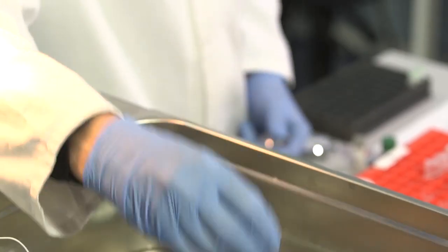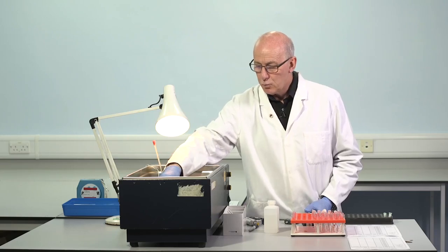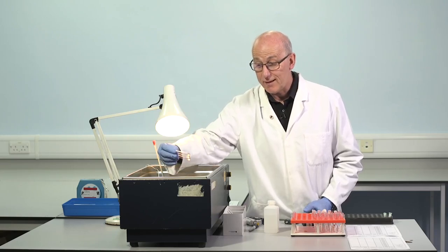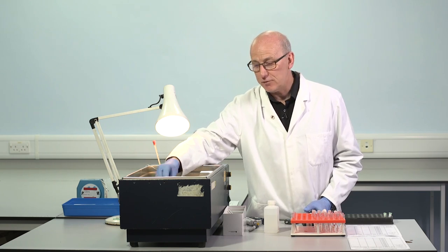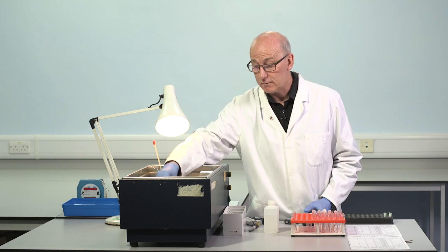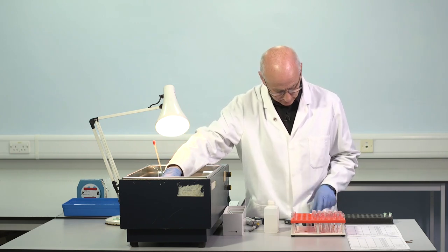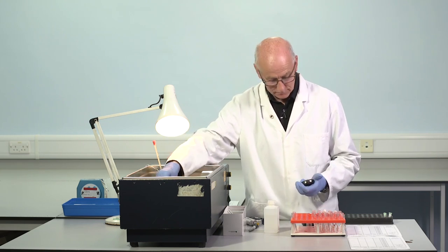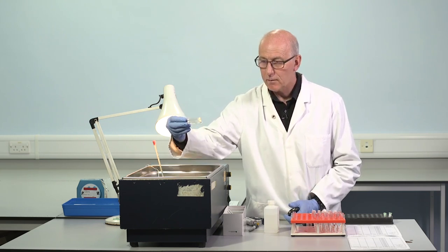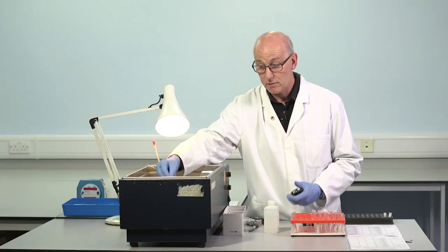So we have a clot in the first tube. Second tube, of course, contains a higher dilution, therefore less factor VIII, and therefore a longer clotting time. Just waiting for the third tube to clot. Lowest level of factor VIII, longest clotting time.